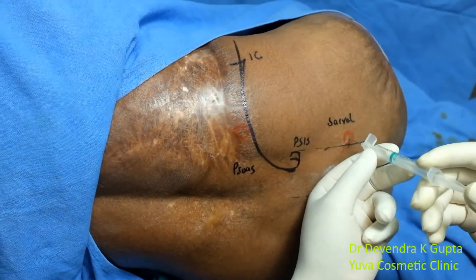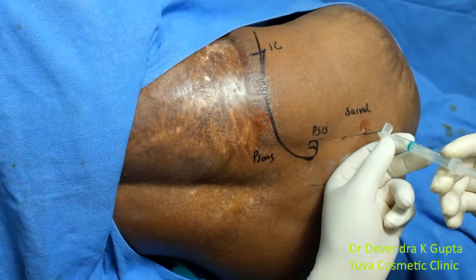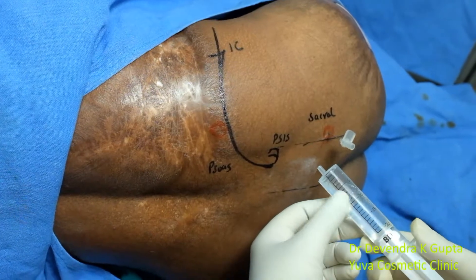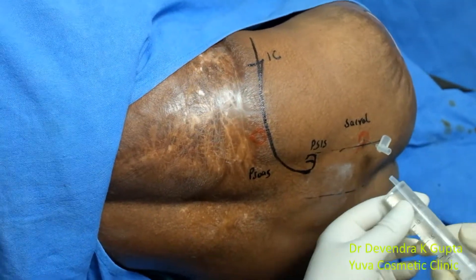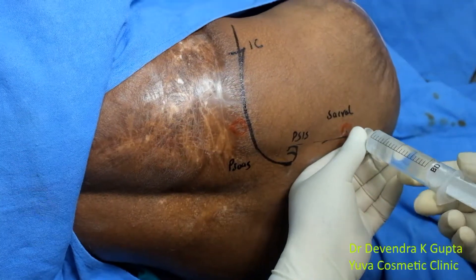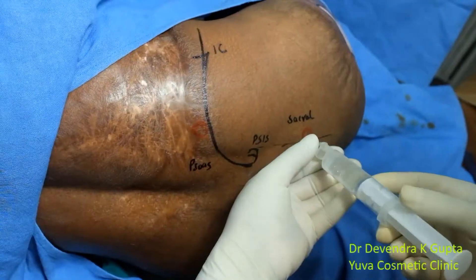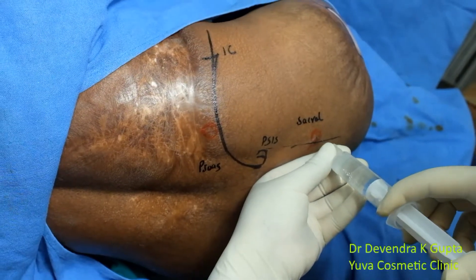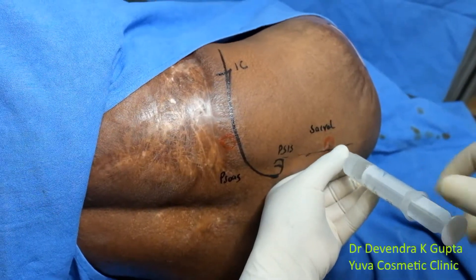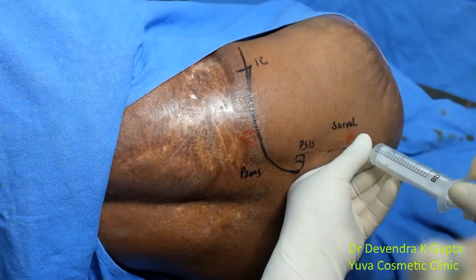Press on the plunger and check for resistance; advance gradually. The anesthetic solution contains 7 ml of 2% lignocaine, 7 ml of 0.5% bupivacaine, and 7 ml of normal saline — a total volume of about 21 ml. Aspirate before injecting and rotate the needle in at least two planes to avoid accidental intravascular injection. The most feared complication in regional blocks is accidental intravascular injection of local anesthetics.